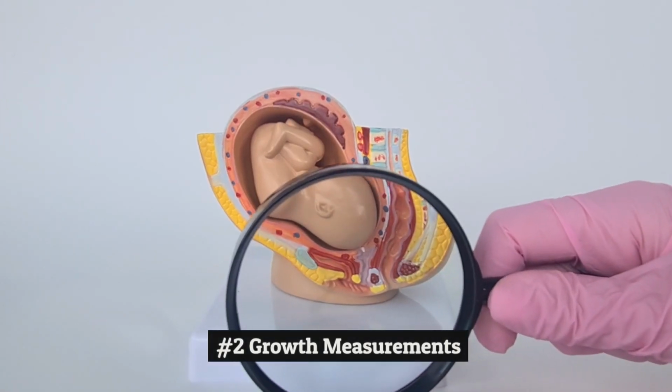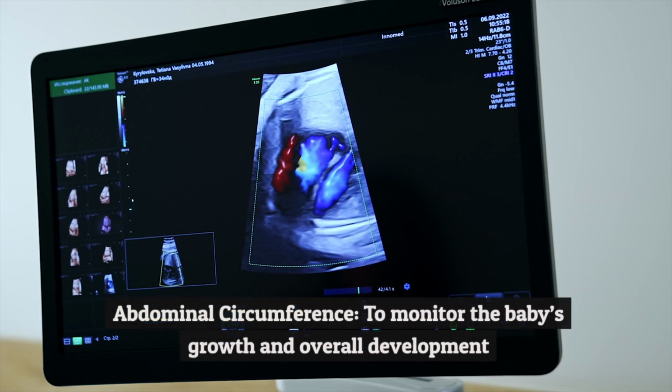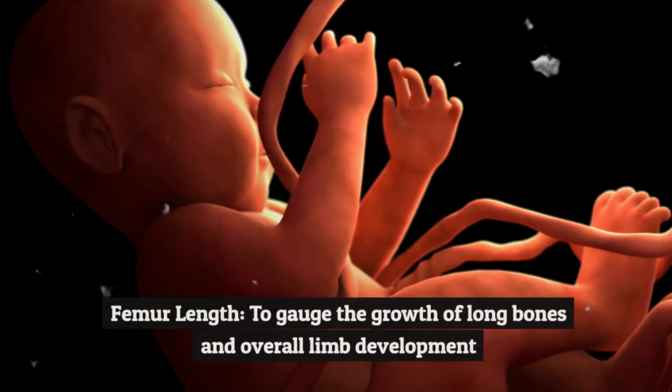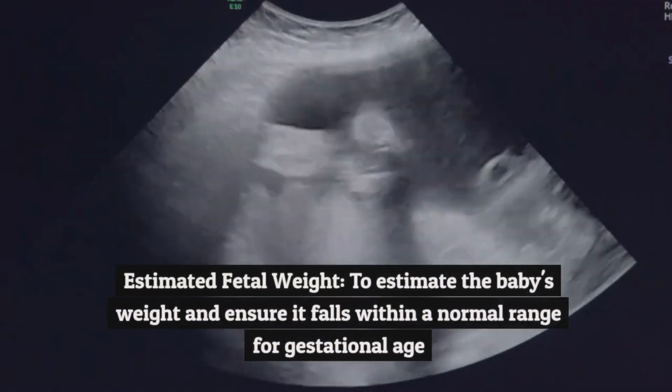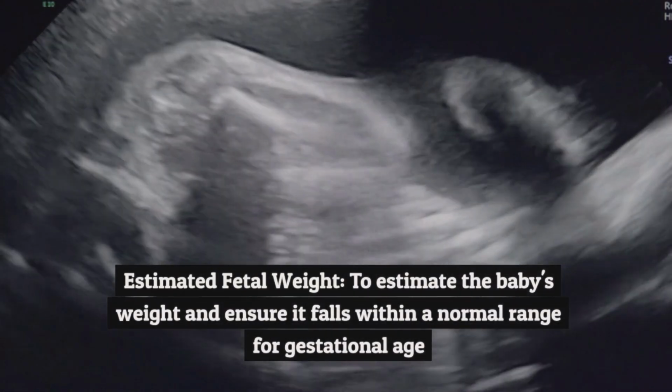2, growth measurements. Head circumference, to assess brain and skull growth. Abdominal circumference, to monitor the baby's growth and overall development. Femur length, to gauge the growth of long bones and overall limb development. Estimated fetal weight, to estimate the baby's weight and ensure it falls within a normal range for gestational age.